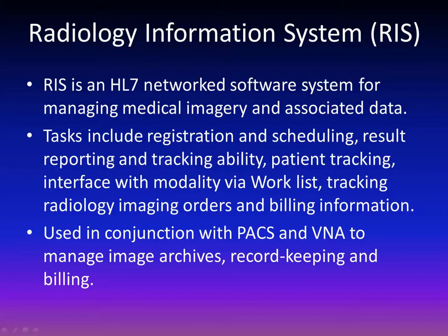Some of the more important tasks that you're going to think of with a RIS system are registration and scheduling, result tracking, reporting, patient tracking, interface with the modality via the work list, tracking of radiology imaging orders, and billing information. The doctor's order and the billing information are always really important. That's part of the job of the RIS.